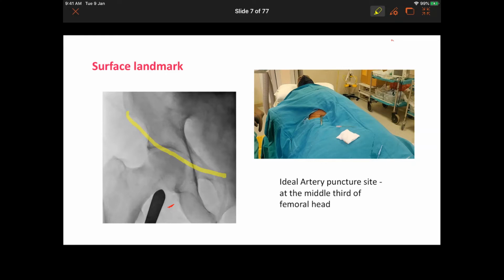If you ask me what the second best technique is, it is to use a hemostat or any opaque object that you have, maybe the backside of a scalpel, and you check on fluoroscopy the position of the inferior border of the head of femur.